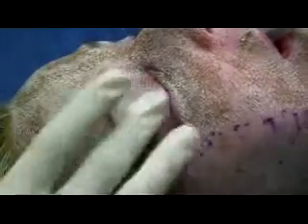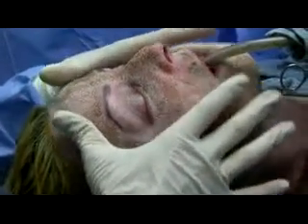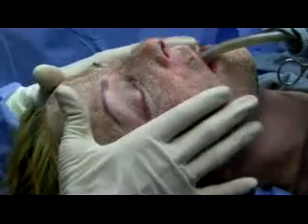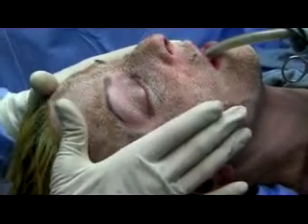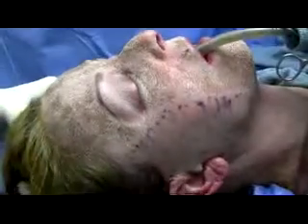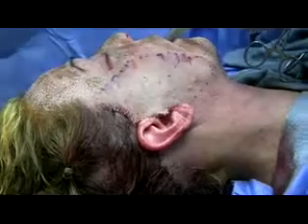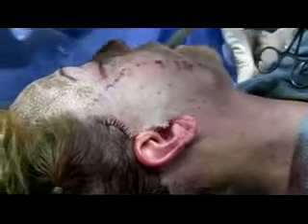And I'm not really worried about, we're not trying to address wrinkles here so much as just to blend everything in. So our central oval of the face, which has not been undermined, is lasered in the traditional fashion. And again, this is old school, fully ablative, take 2 weeks to heal, get a great result, CO2 laser resurfacing. And now we're going to drop to 80 and 4, and we're going to treat the undermined skin. So we're going to keep our fluence where it is, but we're going to change our density to 4.